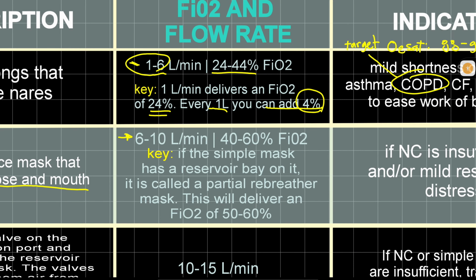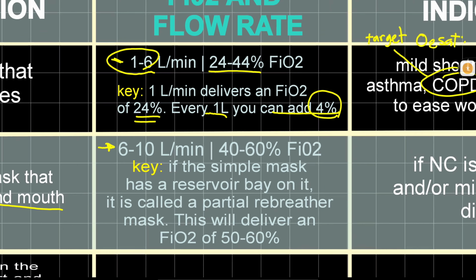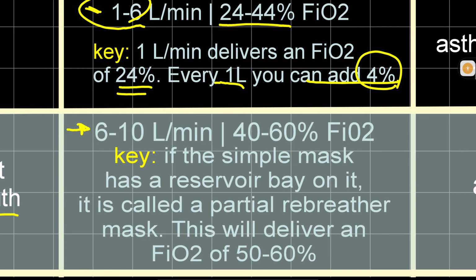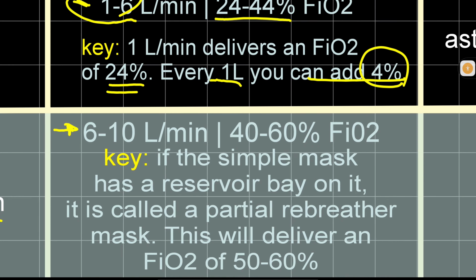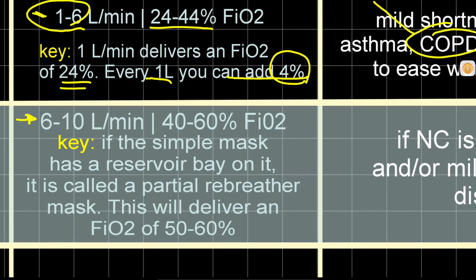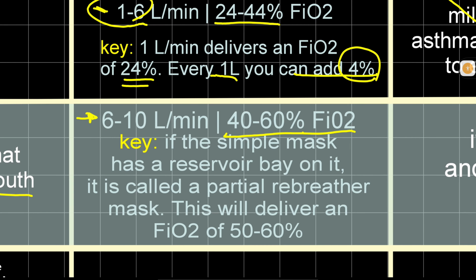You will notice that the flow rate we use increases as we go down this list. From 1 to 6 for nasal cannula, and now you're moving to face mask, 6 to 10. Why is that? Meaning, the oxygen demand of your patient is increasing. So, 6 to 10 liters per minute, and that is equivalent to 40 to 60% FiO2.